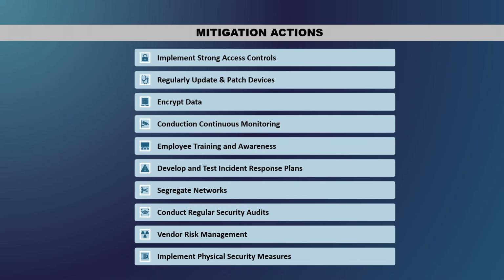And then employee training and awareness, providing regular cybersecurity training to all the healthcare staff, and conducting simulations and drills to prepare for potential incidents. And then developing and testing incident response plans, creating detailed incident response plans, and having tabletop exercises, making sure that they're realistic. Don't just go and sit in a room and say, okay, what happens if malware affects our systems, and then write down a couple of sentences. Actually walk through the steps, take the incident tabletops and simulations seriously, and try to mimic it as much as possible, because you're only as good as your training in a real disaster response or an incident response.